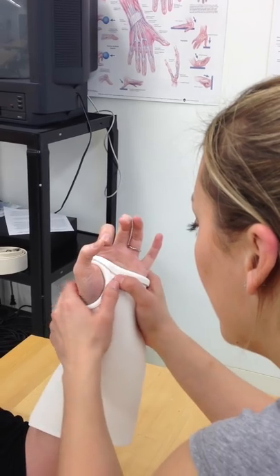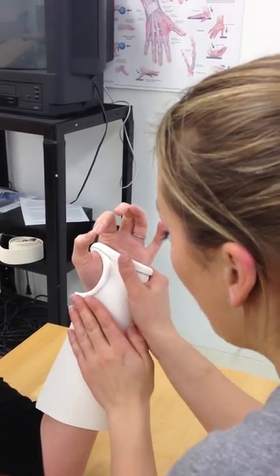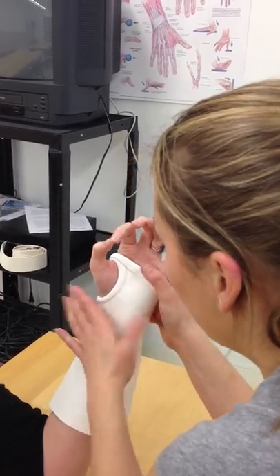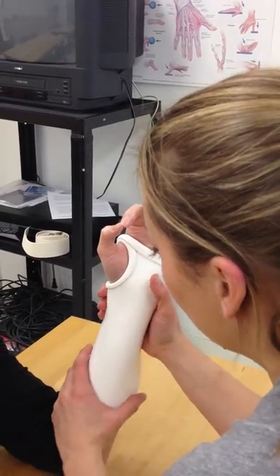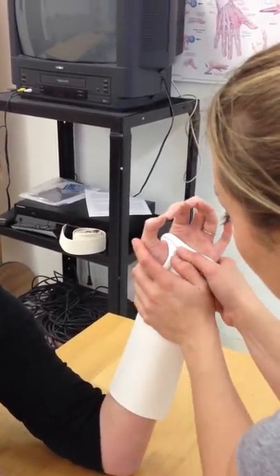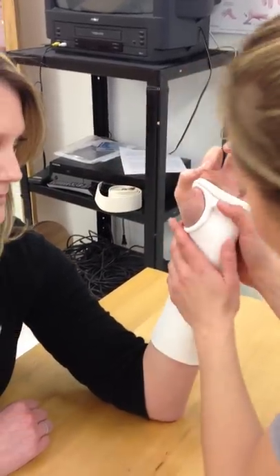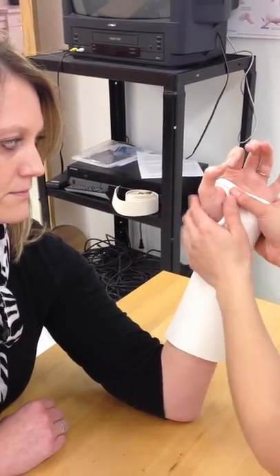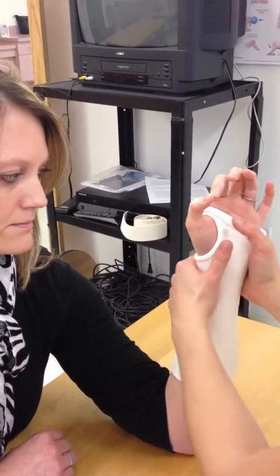Right on that thenar area. Once I get good contact there, I'm going to make sure I'm pressing into the palm. Nice, soft hands — you've got a lot of work with this material. If you press too hard, you're going to have lots of fingerprints. Nice, gentle hands. Get a little bit tighter in that area. That's going to be two-thirds the length of the forearm. I'll keep coming back to this hand portion to make sure it's nice and snug.